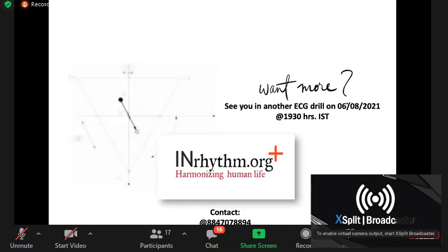sinus arrest means there is no atrial impulse being generated by the SA node. Now, sinus arrest and SA exit block type 3, where there is a prolonged delay in the P wave conduction, are not distinguishable based on the ECG. But they are trying to give some kind of definition for sinus arrest. So electrophysiologically, SA exit block 3 and sinus arrest are the same.